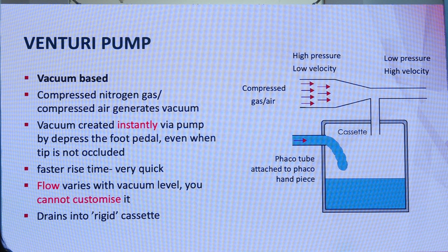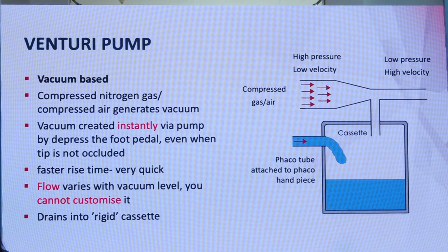The compressed gas goes inside and creates a vacuum in the low pressure zone, and this vacuum is created instantly, immediately. It doesn't get created after the occlusion of the tip. It is created just when you press the foot pedal. So the vacuum is created instantly, even when the tip is not occluded. So there is a faster rise time. You don't have to wait for the vacuum to get created. It is just there, and therefore the system is very quick.